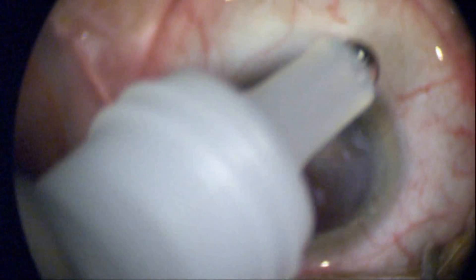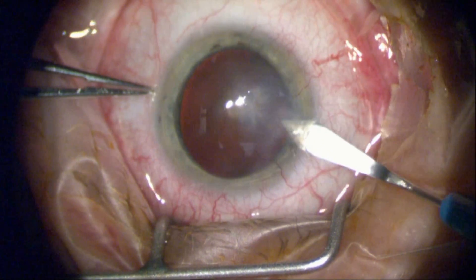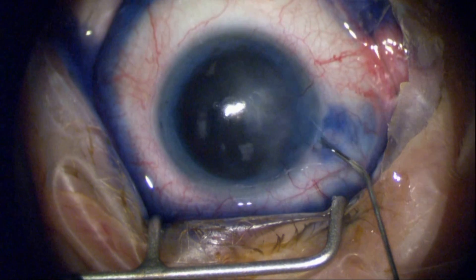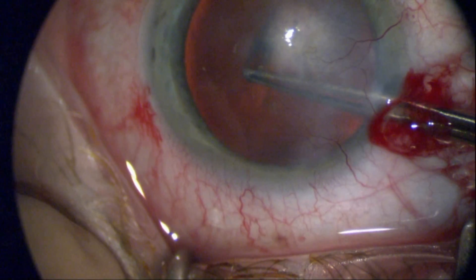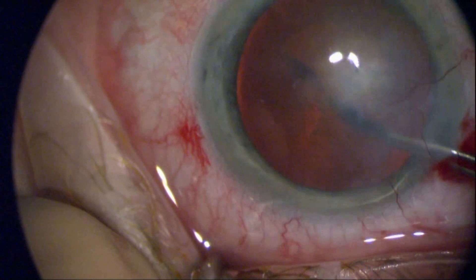I've had a number of fascinating cases this past week, including this gentleman who has a full thickness corneal scar induced by a virus. He also has a cataract that we're going to try to remove here through it with a closed system, rather than the case I did last week where I did all of it in an open sky fashion.